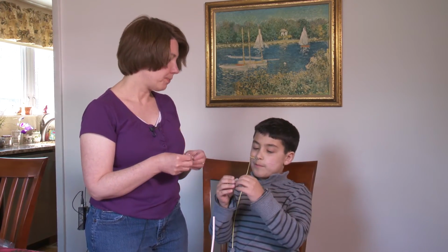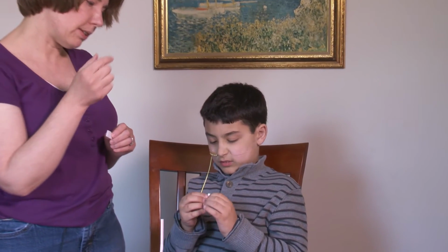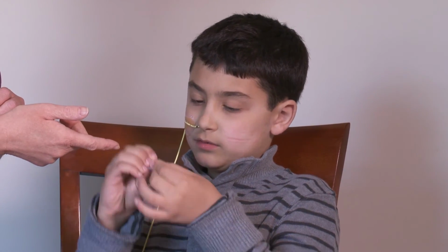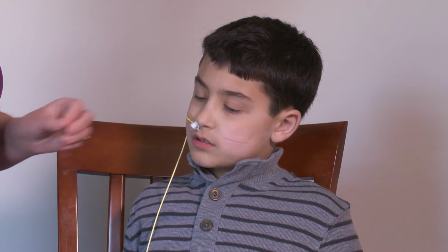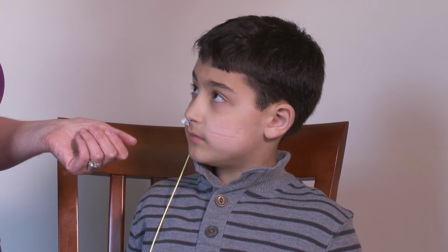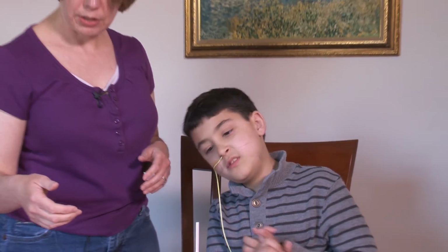So you can roll up a piece of gauze. Noah found that when the tube wiggled around when he moved, it was annoying to him, and he really hated that. So he would roll up a little piece of gauze like this and put it in his nose. Then it kind of kept the tube stable and not moving around, and he felt like that really helped him. He actually did that for the first 3 or 4 months probably, that he had the tube, just to kind of keep it from wiggling around, and that felt better to him. So you're going to find the things that work for you.